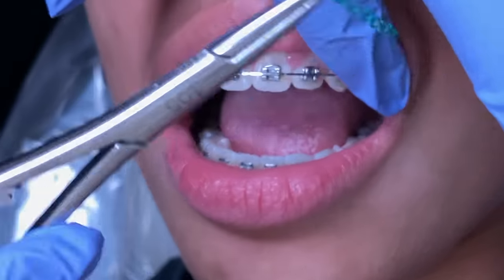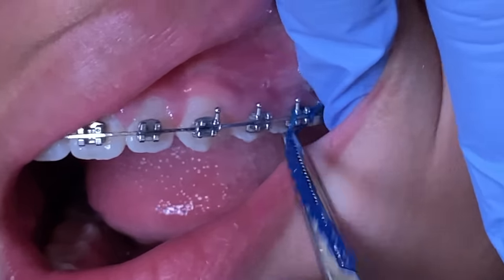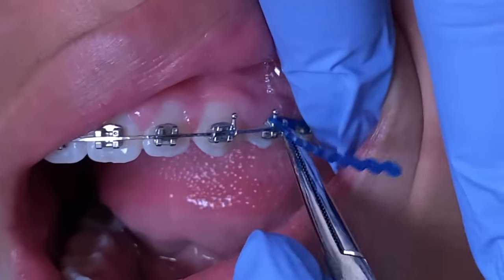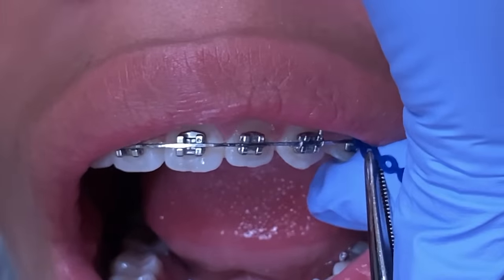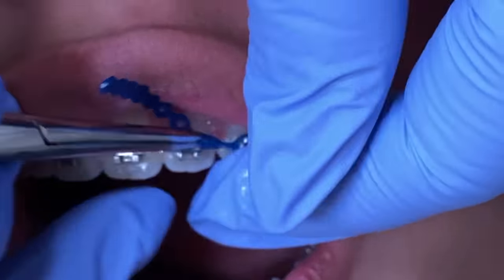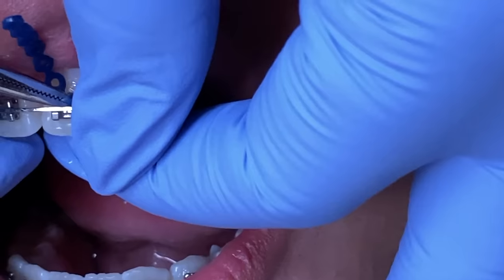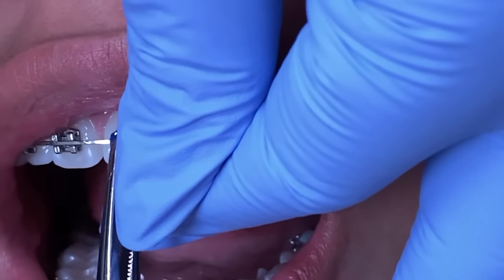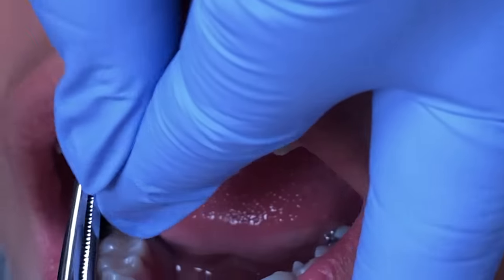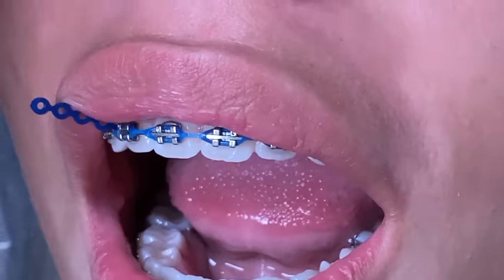But most importantly, you have to make sure you're dedicated and committed to wearing those rubber bands, because it's like homework given to you from your orthodontist to do at home. So in this patient, we refreshed the chains on the top, which is from molar to molar, from the upper right to the upper left. And on the bottom, we refreshed the lower singles, which are the little colored single circles that go around the brackets. If you're wondering why we do singles on the bottom and chains on the top, it's probably because the patient has a little bit of space on the top that we need to close or maintain.